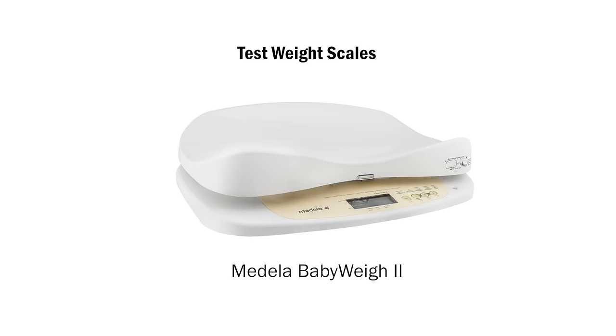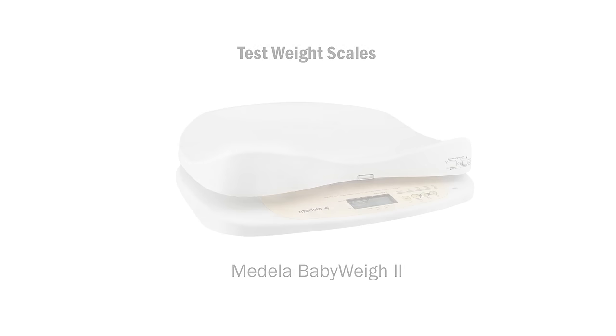A test weight is when a baby is weighed immediately before and after a feed to determine the amount of volume taken during a feed at the breast. For those breastfeeding babies at SickKids whose intake needs to be closely monitored, this is an important tool.